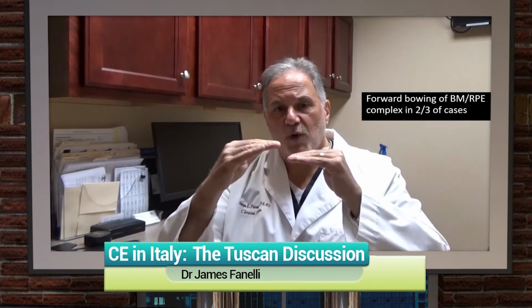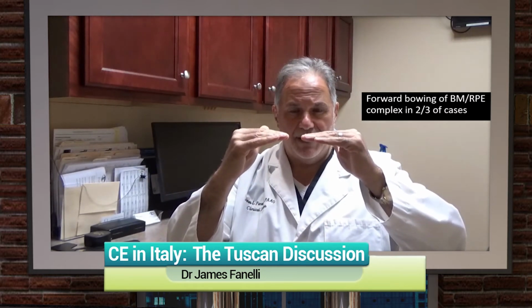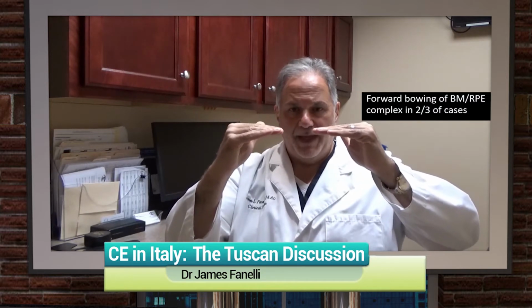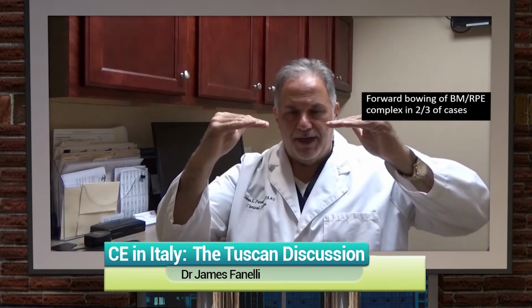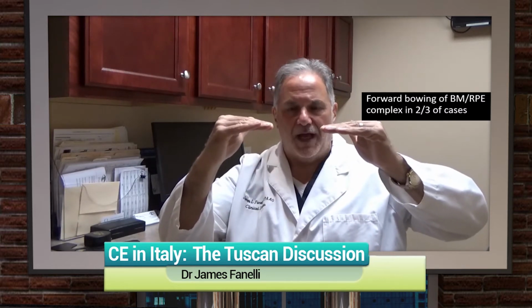But in early to moderate papilledema, the optic cup is going to be preserved. So we're going to see on OCT this forward bowing, and in fact, if this is the nasal aspect of the disc, we're going to see the nasal aspect of the disc somewhat bowed forward. Usually, in a healthy eye, the posterior segment is going to have uniformity between Bruch's membrane and RPE complex on the left, nasal and temporal side of the nerve.